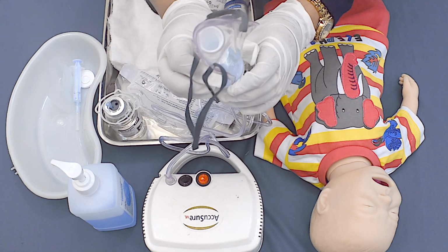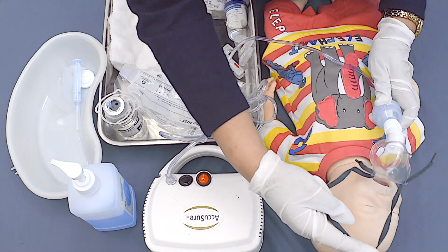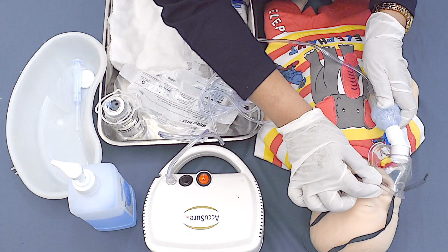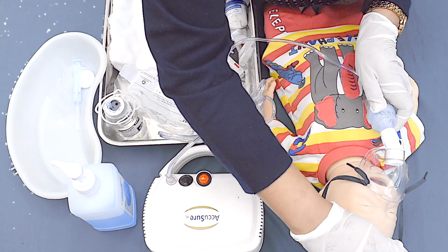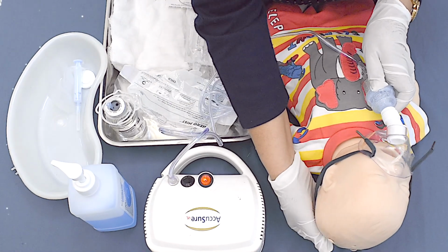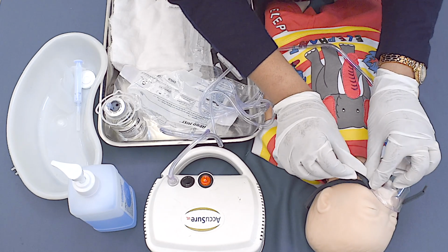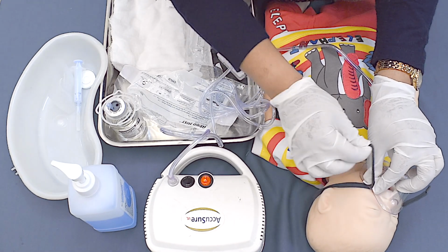Now this face mask has to be applied over the face of the baby, covering the mouth and the nose. The mask should be snugly fitting over the nose and the mouth of the baby.